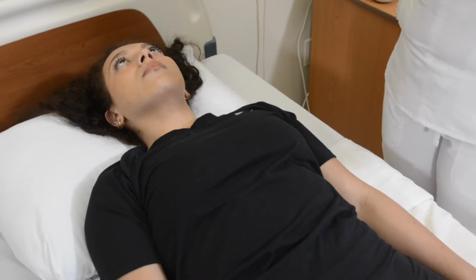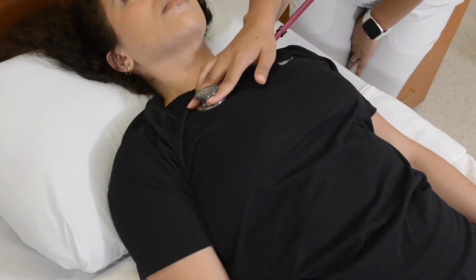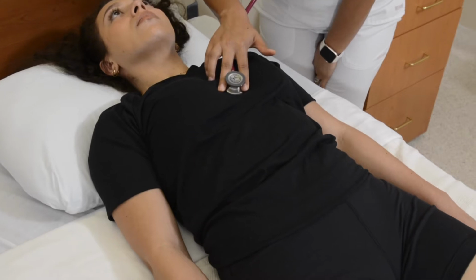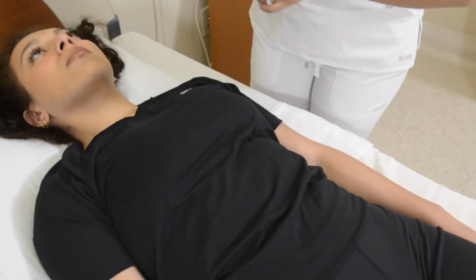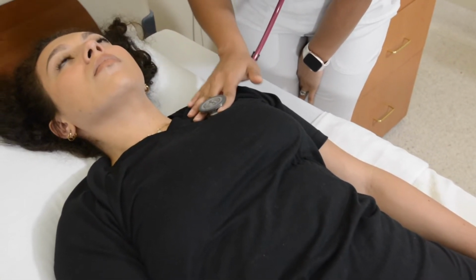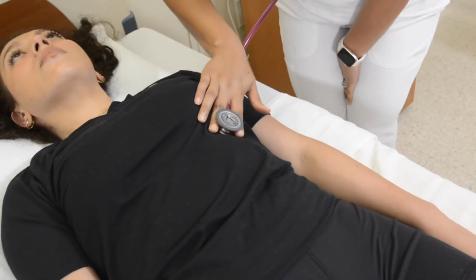Now I'm going to listen, just like I did before. First, with the diaphragm part of my stethoscope, we go aortic, pulmonic, Erb's point, tricuspid area, mitral area. One more time, the bell part: aortic, pulmonic, Erb's point, tricuspid, and mitral area.